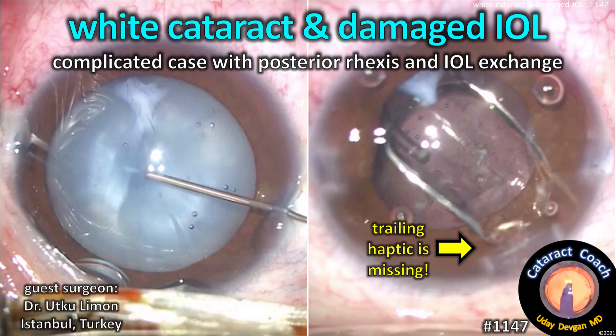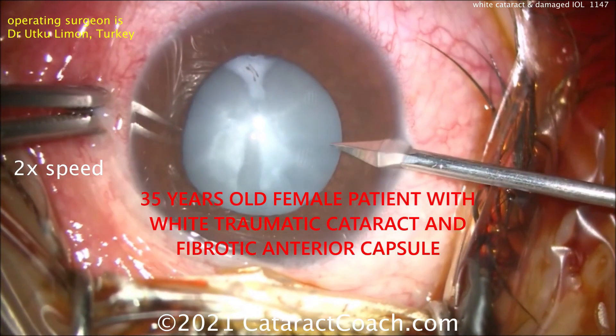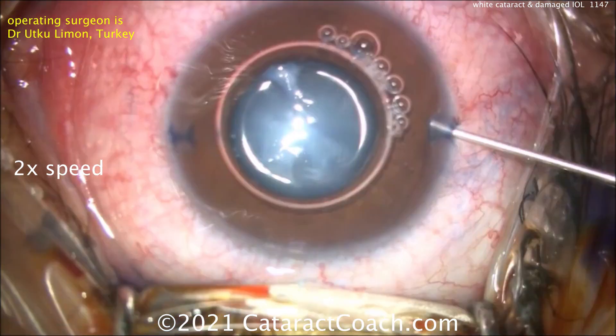Cataractcoach.com presents a white cataract and a damaged IOL — a complicated case with a posterior rhexis and even an IOL exchange. Our guest surgeon is Dr. Utku Limon from Turkey. We have a 35-year-old patient with this cataract, and you can see some trypan blue dye going inside the eye now.